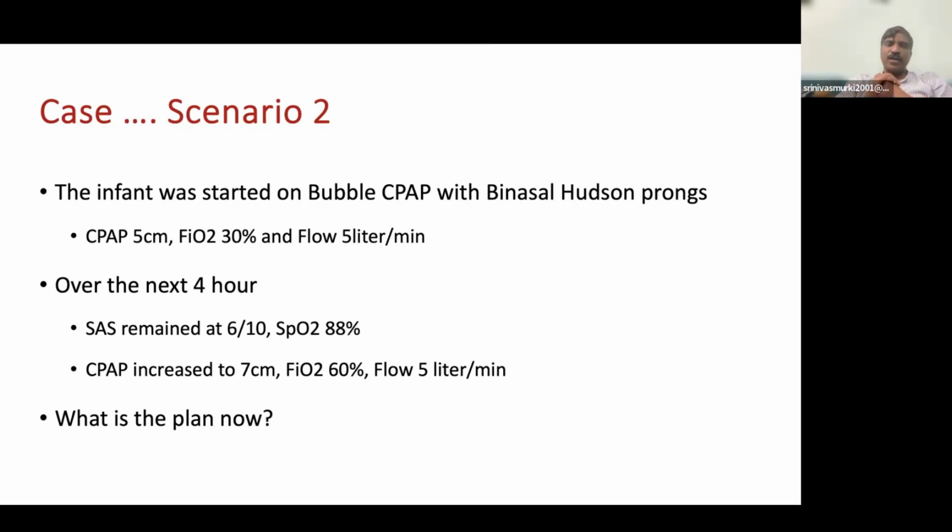But before you go to nasal IMV or ventilation, first you have to see whether your CPAP is adequate or not. That means you are able to deliver the pressures to the lung. Bubbles are heard, bubbles are seen, whether humidification is all right or not. Temperature is 37, there is no condensation in the inspiratory limb, and FiO2 30% you are setting, whether actually delivered is 30% or not. So you need to cross check the blender using a FiO2 monitor. So if you have done all this, then get an X-ray and see whether you are dealing with RDS or some other disease.